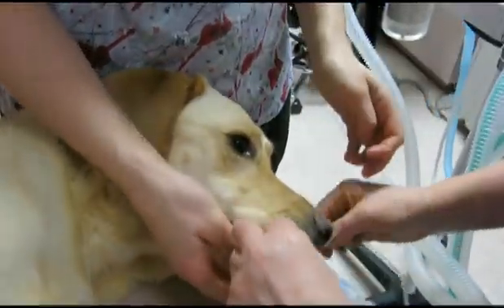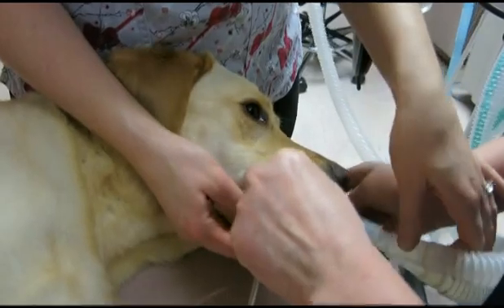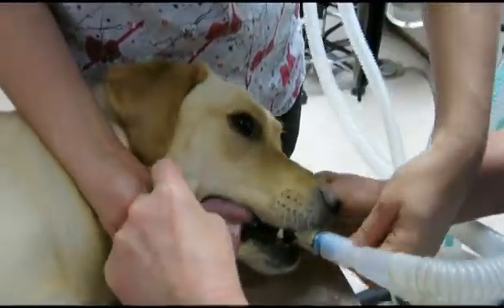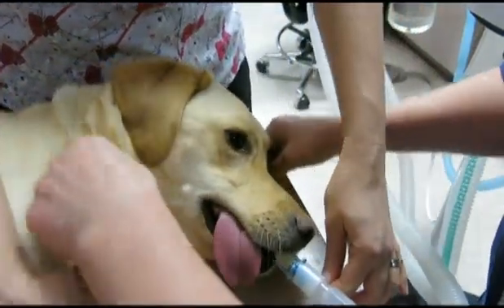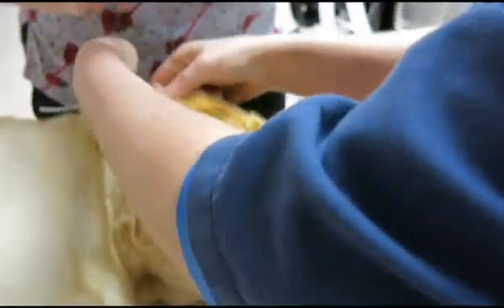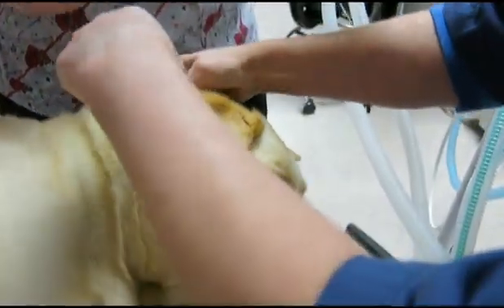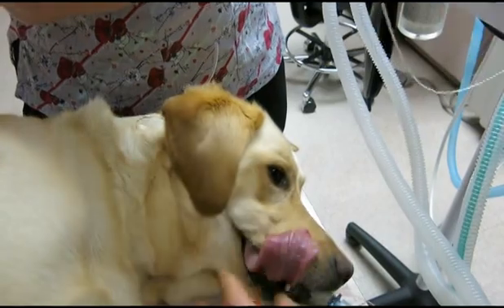As you can see, our patient is a little bit awake — she's in light anaesthesia. We are tying the tube in place. She's still, and the gas will put her deeper.